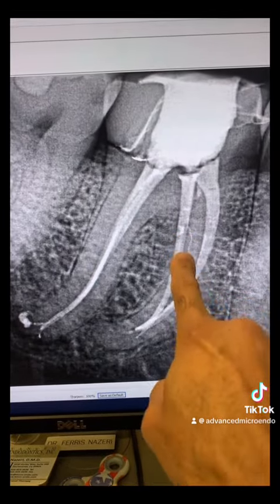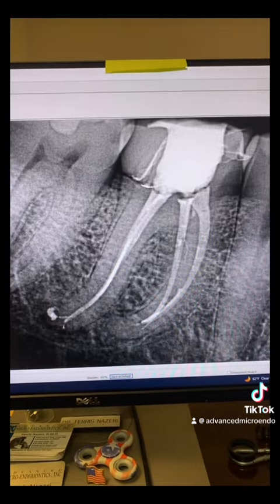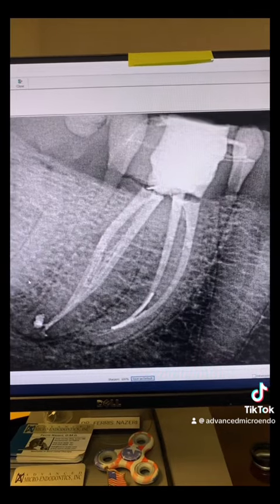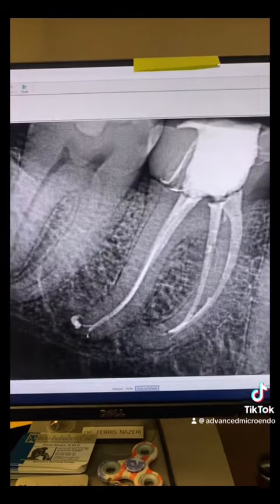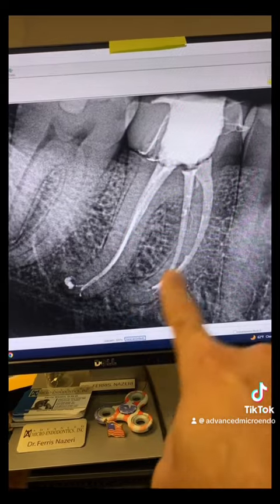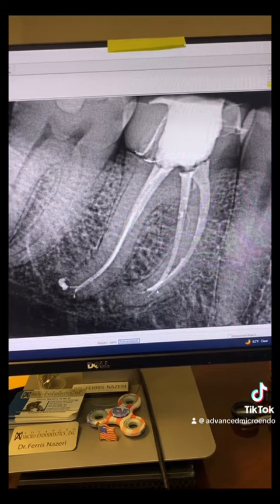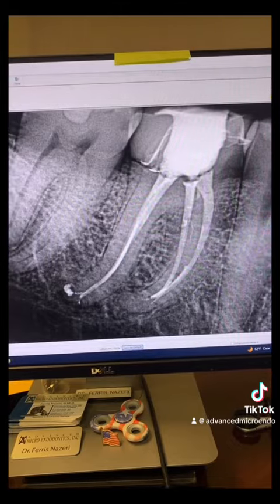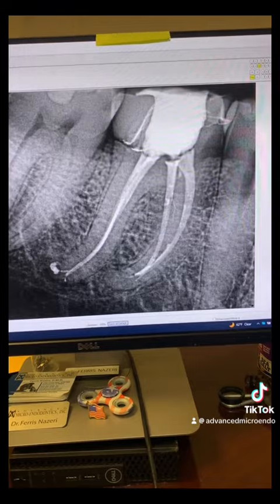By the way, look at all of this anatomy I picked up. Look at all of that. But that's pretty much what's happening. Overlapping of the gutta percha over gutta percha, and then the angulation of the x-ray. There is no broken file here, as you can see. But now suddenly here it looks like there's a broken file. See? Same with the mesial canals. When the gutta percha overlaps, folds and overlaps and compacts on top of the other gutta percha, and the angulation of the x-ray gives you the impression that perhaps maybe that's a broken file, but again, it's not.